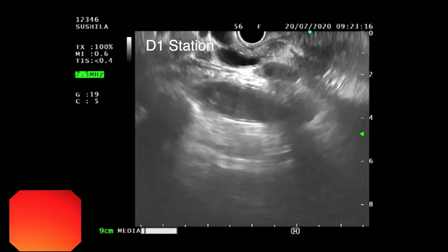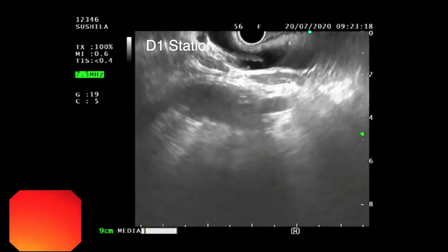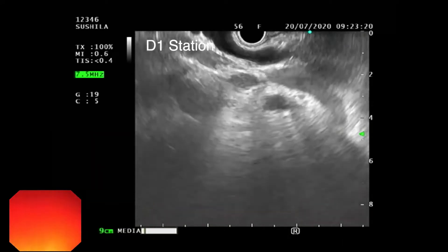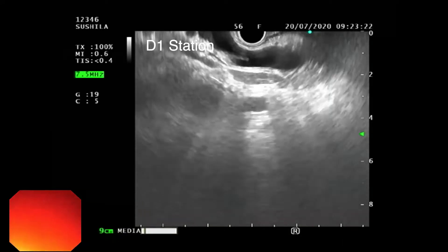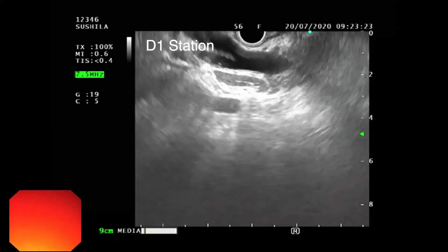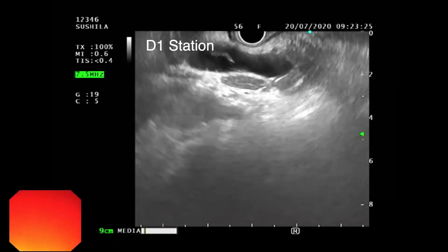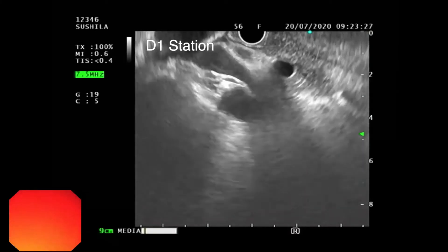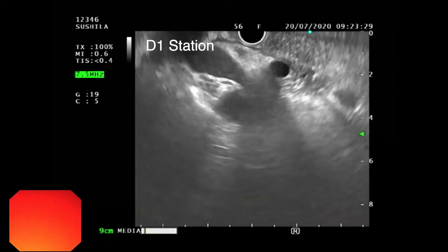By doing clockwise rotation, you can reach towards the lower portion of the CBD and the adjacent pancreas.